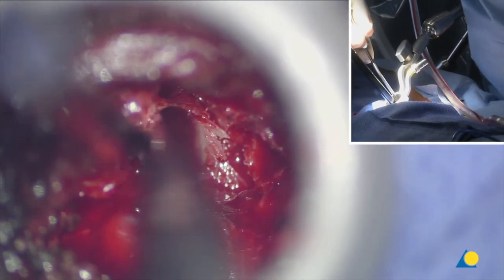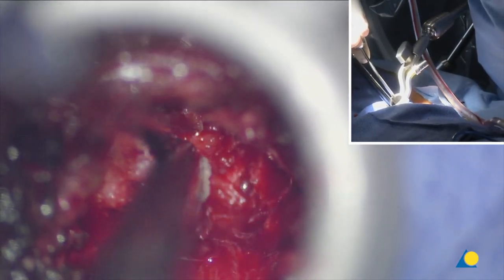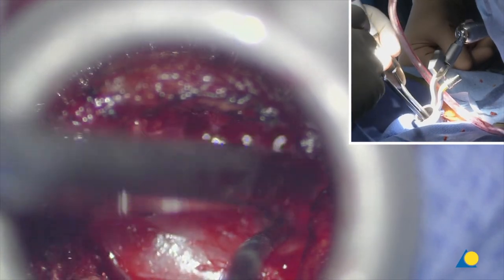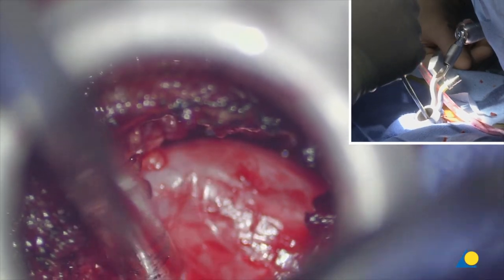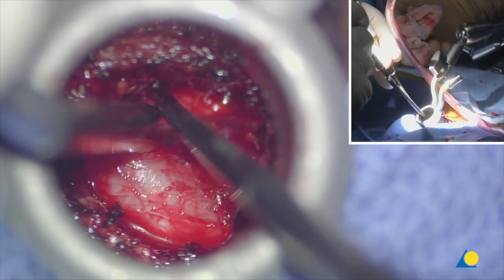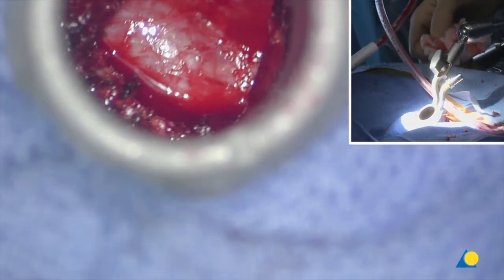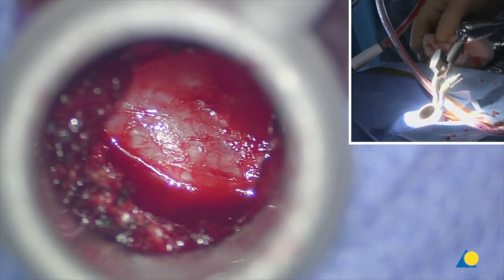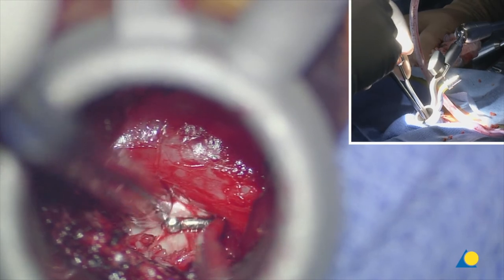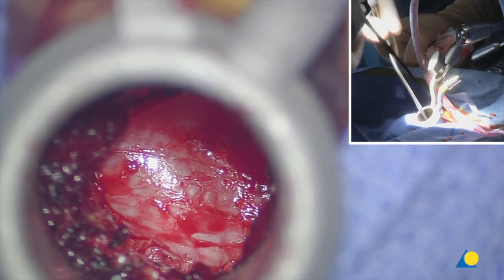I look at the dura while I'm pulling. If there's a CSF leak, this is usually where you get it. Working caudally and over the top. We've got nice decompression — contralateral, ipsilateral — all the way ipsilateral. I can feel the disc space. Contralateral totally decompressed. I can feel the pedicle — that's the L4-5 foramen. Ipsilateral also completely decompressed. There's the disc space, you can see the disc. All the ligament is gone and it's nicely decompressed.